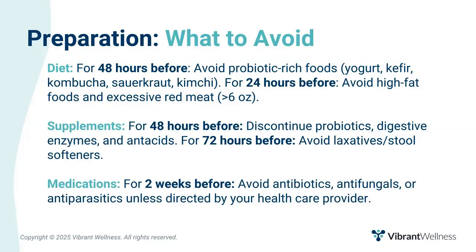In summary, nearly everything ingested, whether dietary, supplemental, or pharmaceutical, can influence gut zoomer results. Therefore, doing a dietary intake recall or asking patients to keep a diet, supplement, and medication diary in the days leading up to stool collection may provide valuable context and enhance clinical interpretation of Gut Zoomer test results.